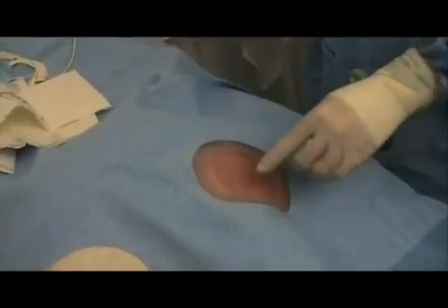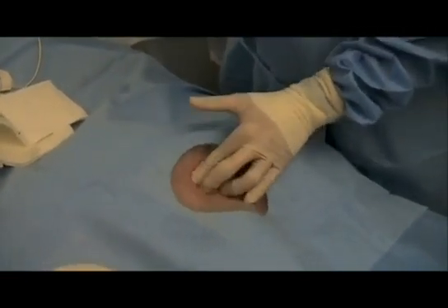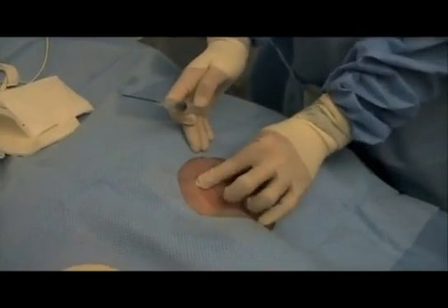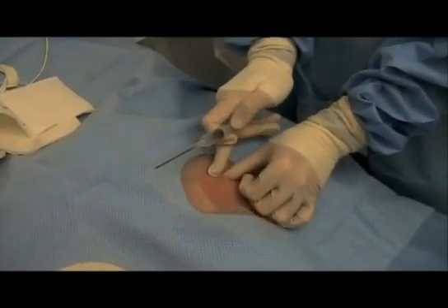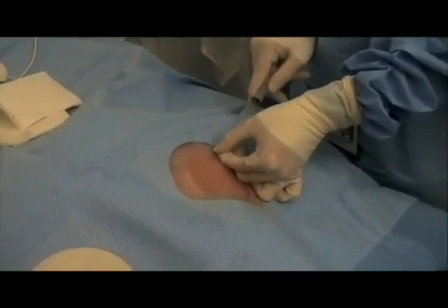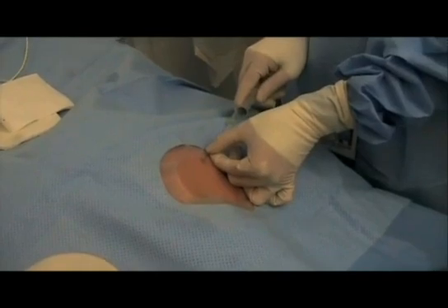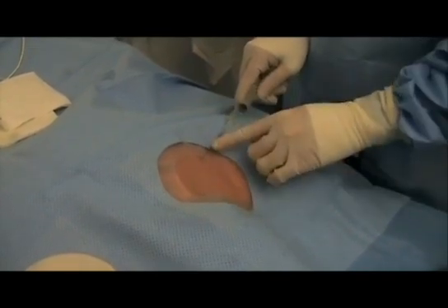When we're ready to see this on the real patient, we'll find our sternal notch, find our clavicle, find that transition point where it goes from straight to curved back, and I'll start a centimeter back at the skin. Now I like to hit the bone — I'm hitting the bone right now. I actually feel my needle hitting bone.